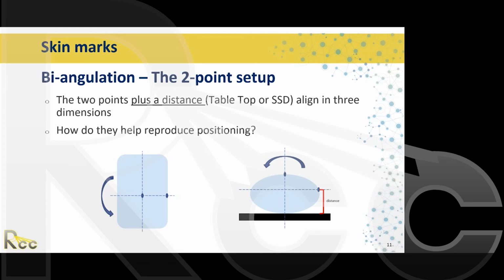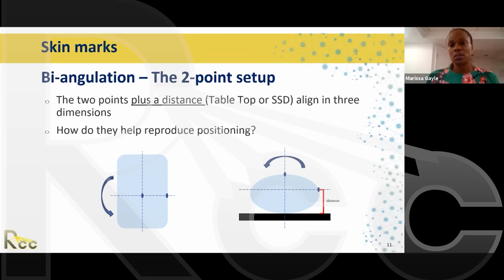Thank you. Another question is, for pelvic cases, do you include a portion of the abdomen in your images? Yes, sometimes we do include a portion. It just depends on everybody's anatomy. Sometimes the doctor will ask us to scan more than is necessary, especially if they know there's maybe some other things going on. Also, if you're scanning higher, a lot of times the doctor will ask for the patient to drink the gastrografin. That will be the contrast that they can drink, and it will highlight the intestines.